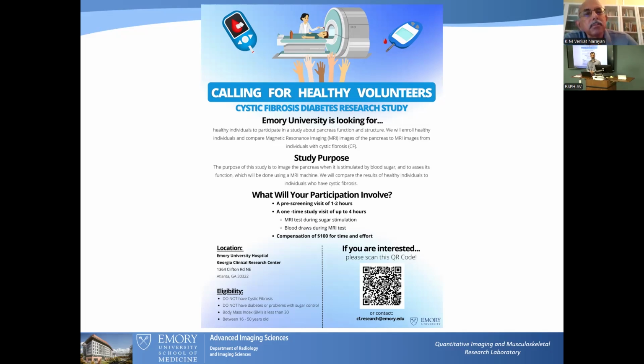Yeah, the phosphorus spectroscopy has certainly been applied to some of the larger internal organs. The challenge is, for instance, it's been used in the liver, particularly in the study of diabetes. It's very specific to different types of changes in these phosphorus-containing metabolic pathways, but its sensitivity is really low, and that's the challenge with it.